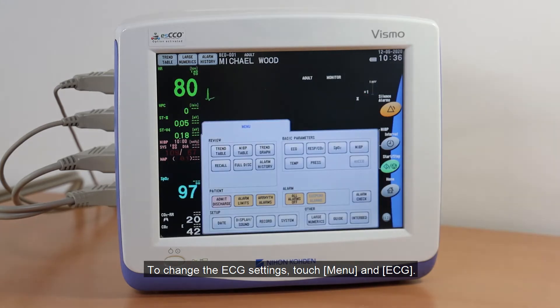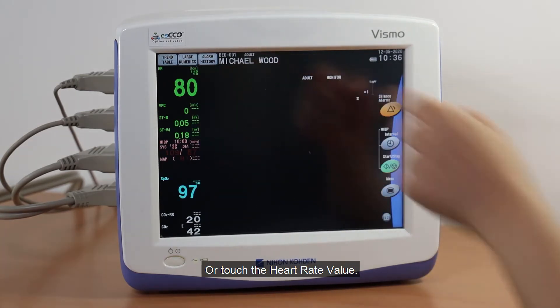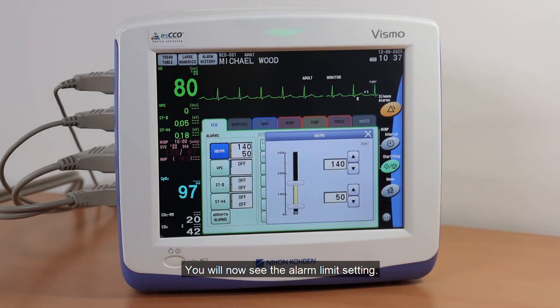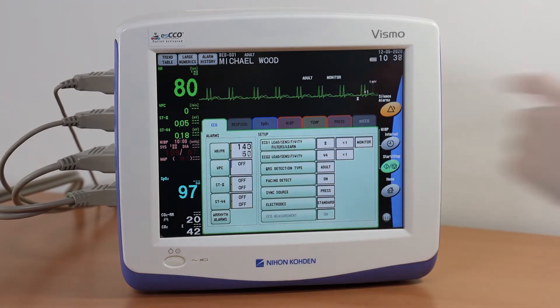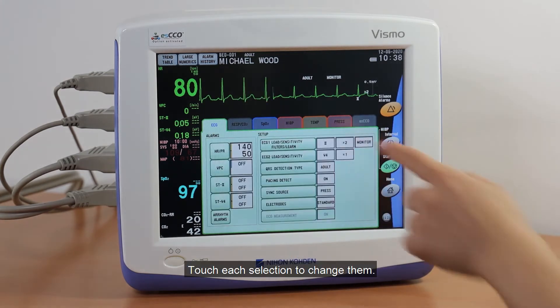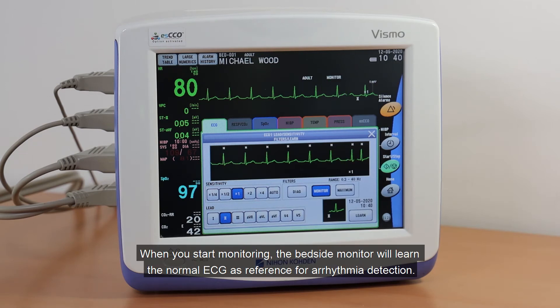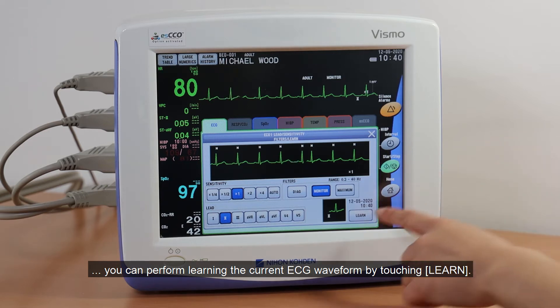To change the ECG settings, touch Menu and ECG, or touch the Heart Rate value. You will see the alarm limit setting. It is possible to adjust the upper or lower alarm limit by touching each parameter. You can also find the sensitivity and lead setting. When you start monitoring, the bedside monitor will learn the normal ECG as a reference for arrhythmia detection. If the arrhythmia detection is inaccurate due to a change of the ECG baseline, you can perform learning the current ECG waveform by touching Learn.